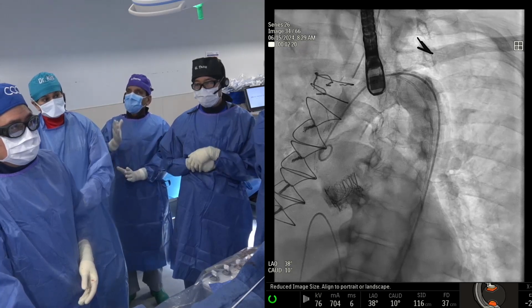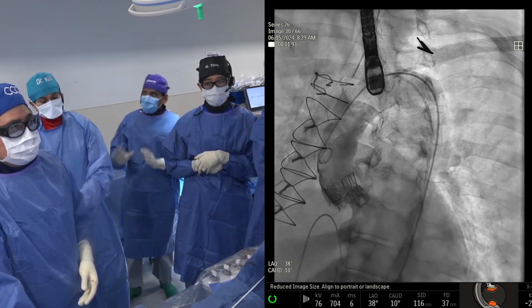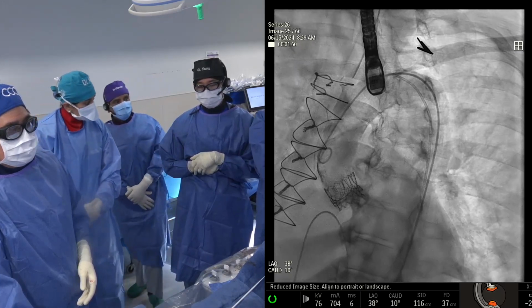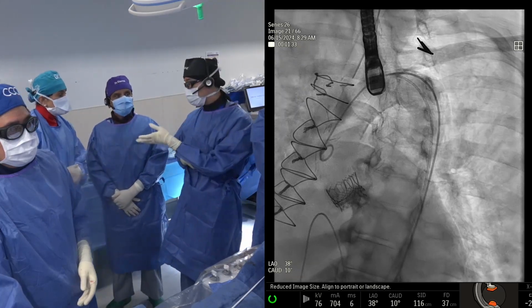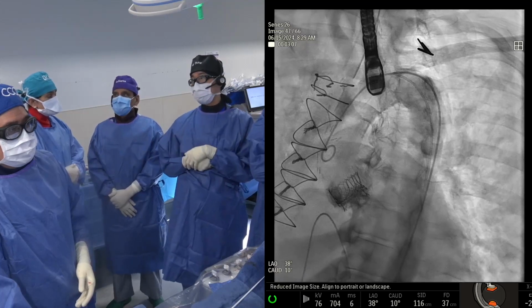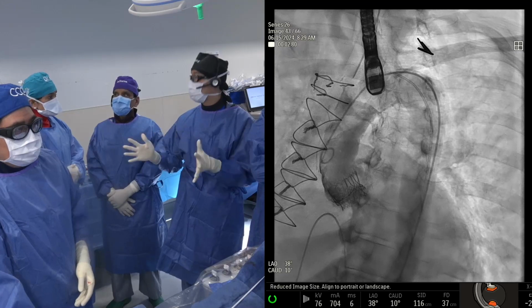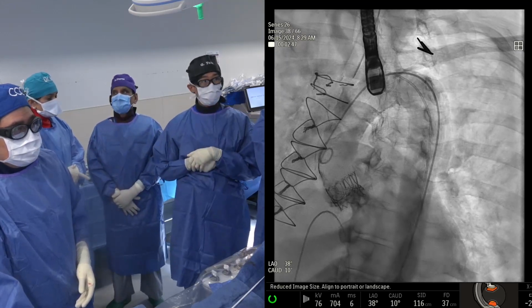The second question is, do you fracture pre or post? I think we have learned that pre is better than post. All the data have shown that if you need to fracture, you do it pre, not post. In this particular case, before we start fracturing, we can post dilate like here and still expand and drop the gradient, even for a self-expanding valve. If you worry about fracturing and causing harm to the patient, don't do it, but you can post dilate safely. Just use the same balloon the companies recommend.